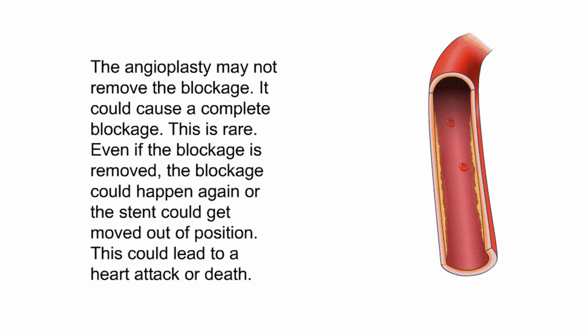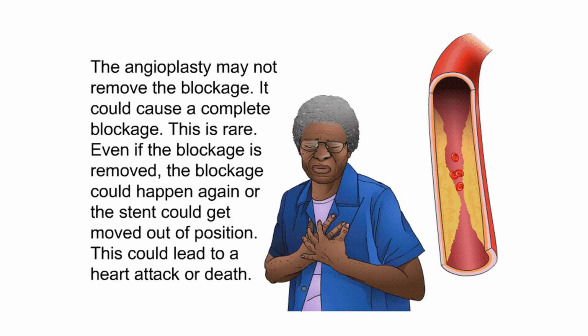The angioplasty may not remove the blockage. It could cause a complete blockage. This is rare. Even if the blockage is removed, the blockage could happen again, or the stent could get moved out of position. This could lead to a heart attack or death.